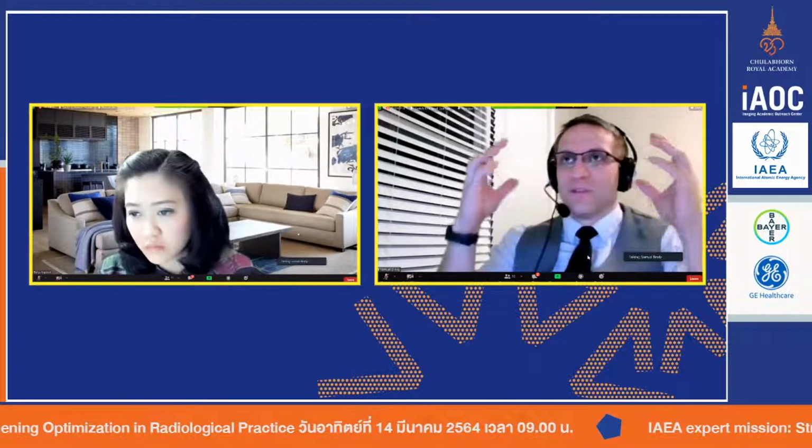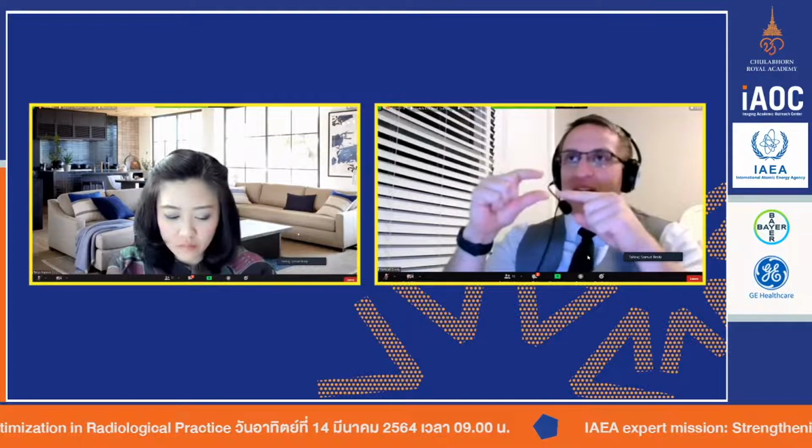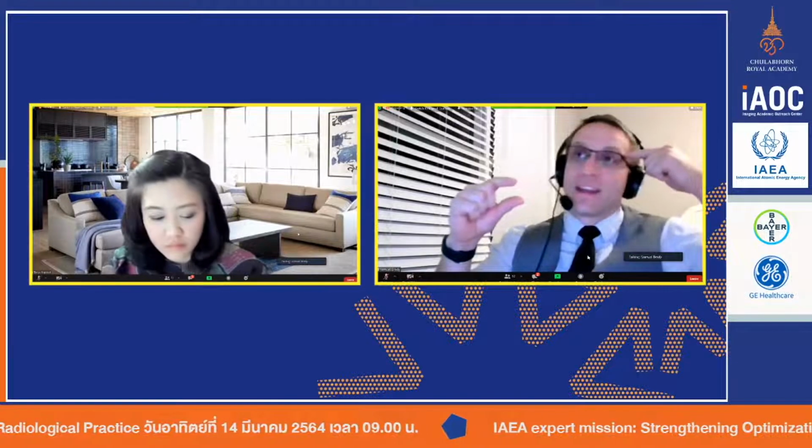fractures. And even if the image is noisy, you can still see a fracture. But the thicker image would be if you're looking at the parenchyma and trying to differentiate gray-white matter, looking for mass effect where it's shifted, or looking for subtle infection or tumor, then you want to make that image the best looking. So you pick the slice thickness that you ultimately want to look the nicest, and you set the dose for that, even though you're still acquiring everything at 0.5 millimeter.